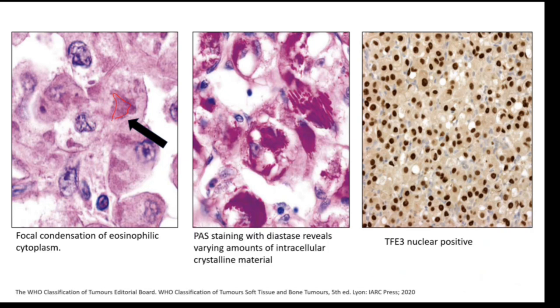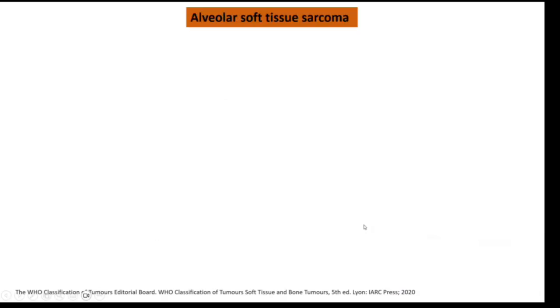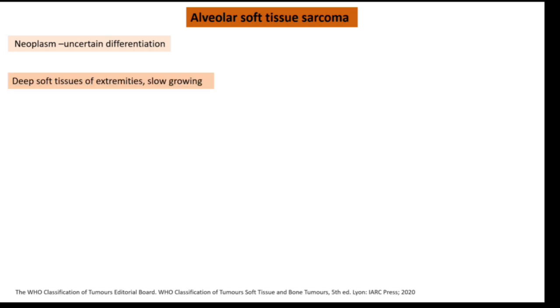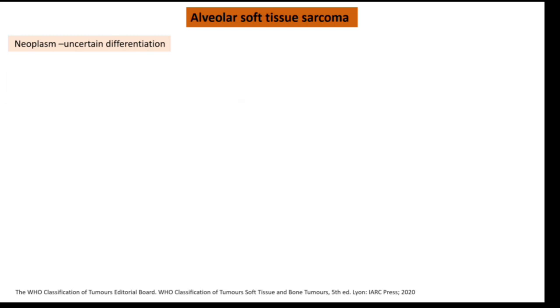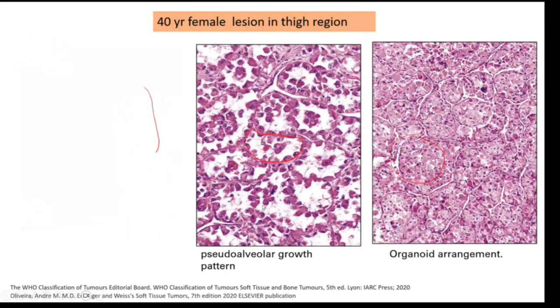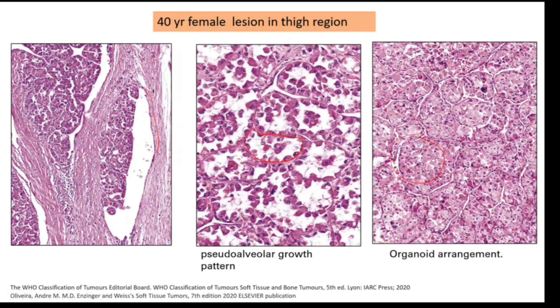The eosinophilic material was positive for PAS but it is diastase resistant. If it were diastase sensitive, we would think it is glycogen — but it is not. So the answer is alveolar soft part sarcoma. The cell of origin is unknown. This occurs in the extremities and is slow growing. Tumor cells are arranged in a nest, alveolar, and organoid pattern, separated by nice vasculature with well-defined blood vessels.